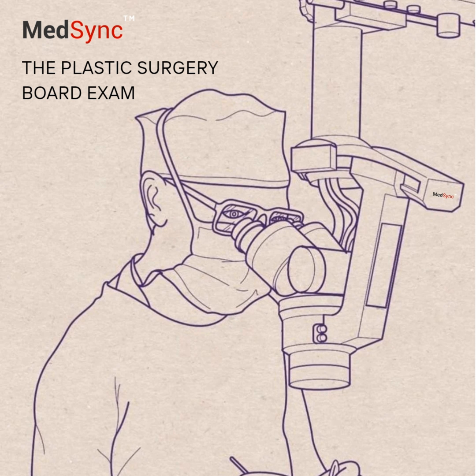Let's focus on acute wounds first. Big soft tissue injuries, contaminated wounds. Right. For those, the prerequisites are key. Thorough surgical debridement of all non-viable tissue. Get rid of foreign bodies, make sure hemostasis is achieved. And ideally, if there are vital structures, exposed vessels, nerves, bowel, you'd want to cover those with local tissue if possible before putting NPWT on. And if contamination or sepsis is a concern? Then you're looking at more frequent dressing changes, maybe every 24 hours initially, alongside appropriate systemic antibiotics and possibly repeat debridement.